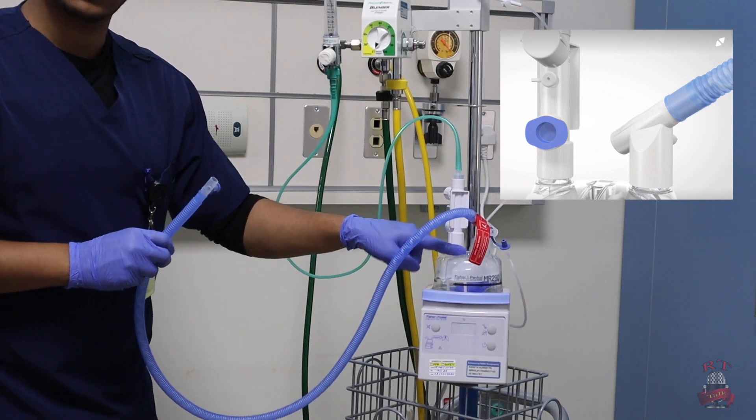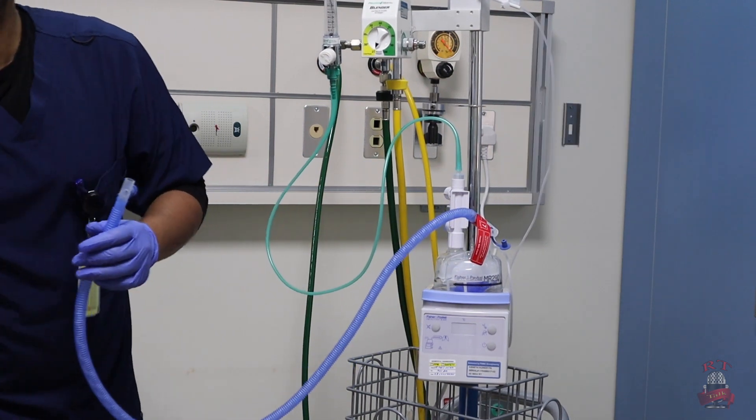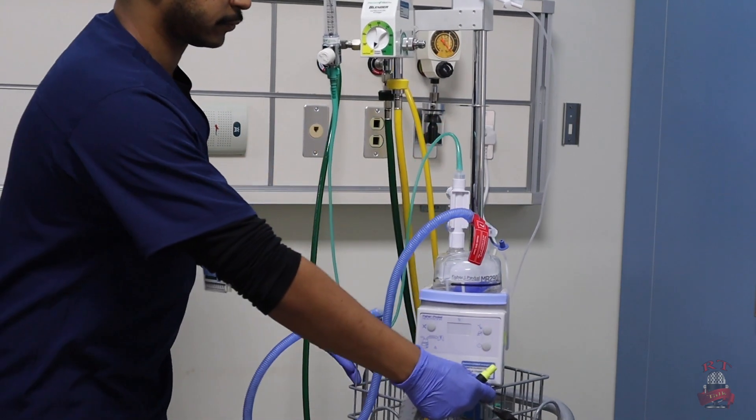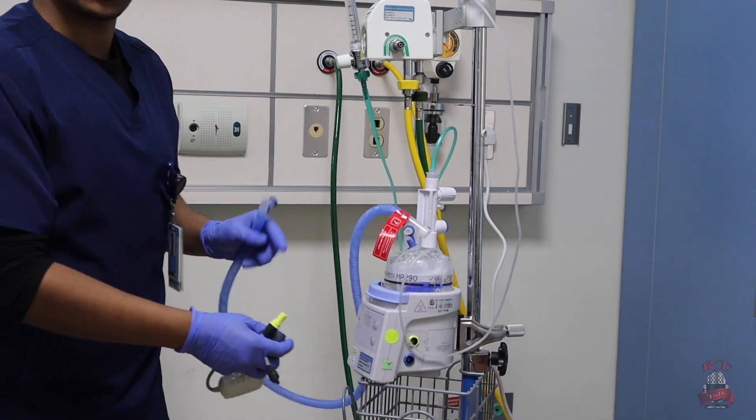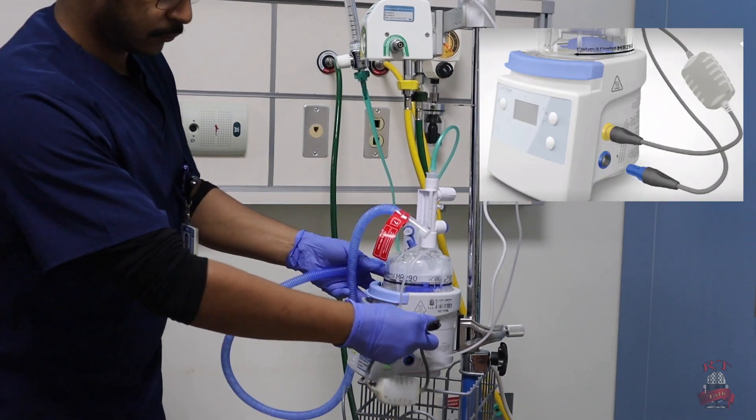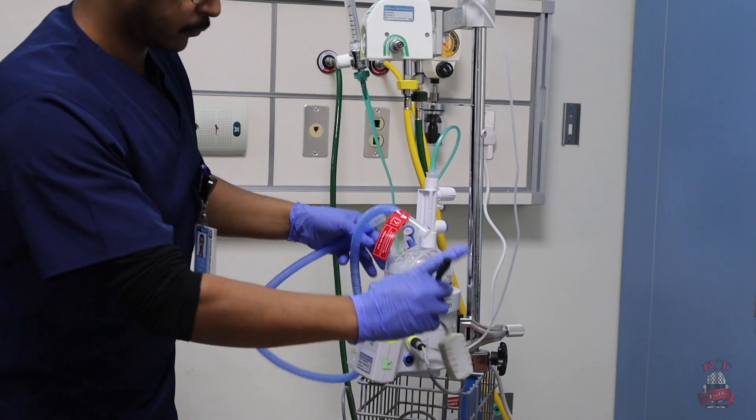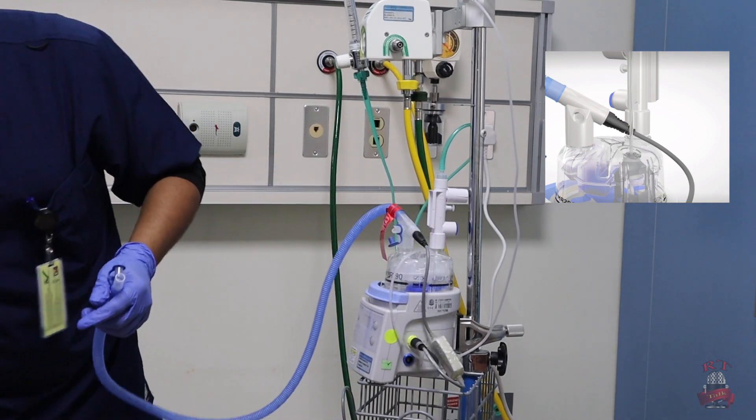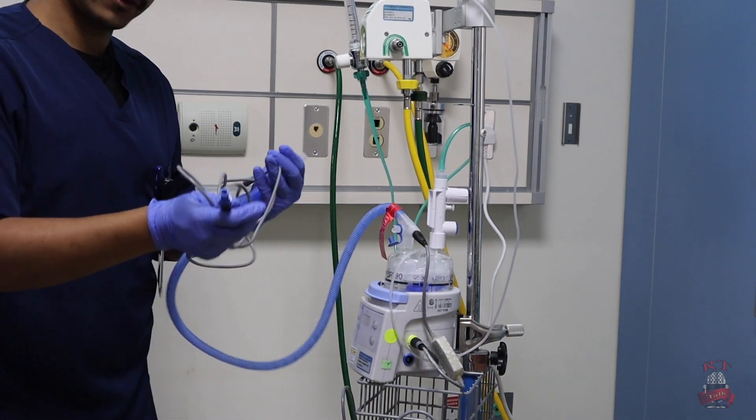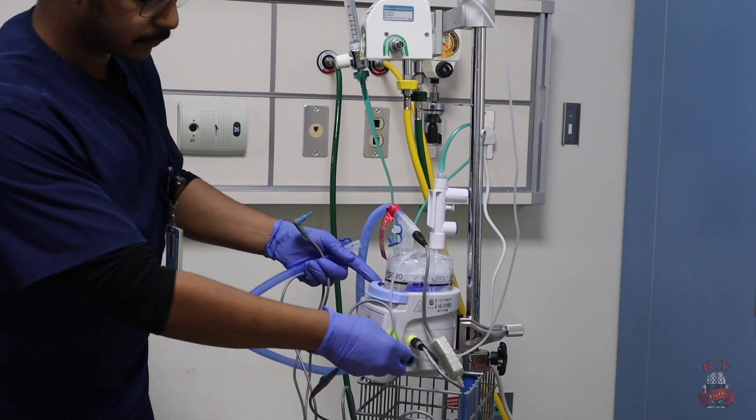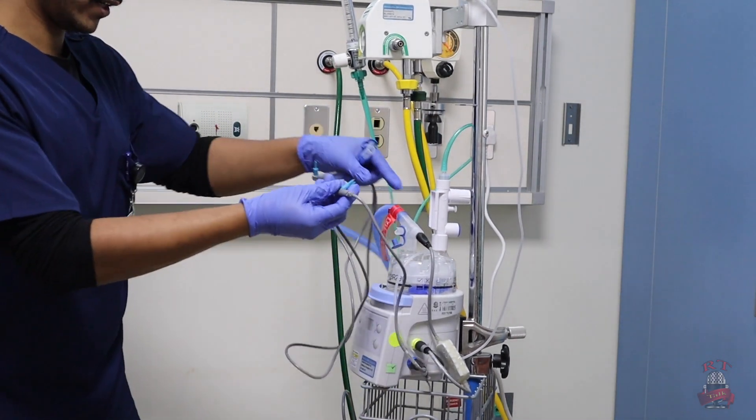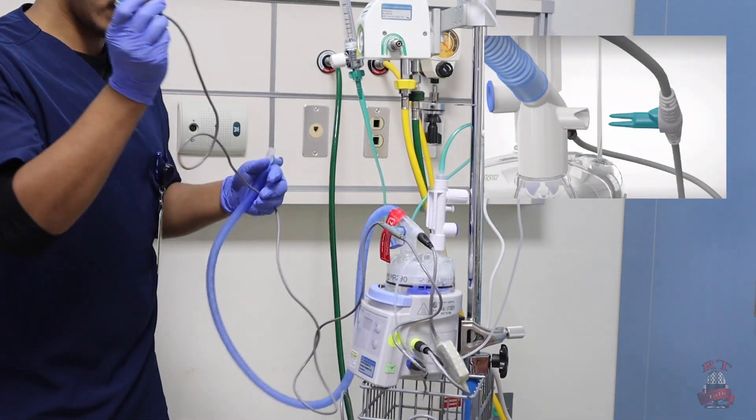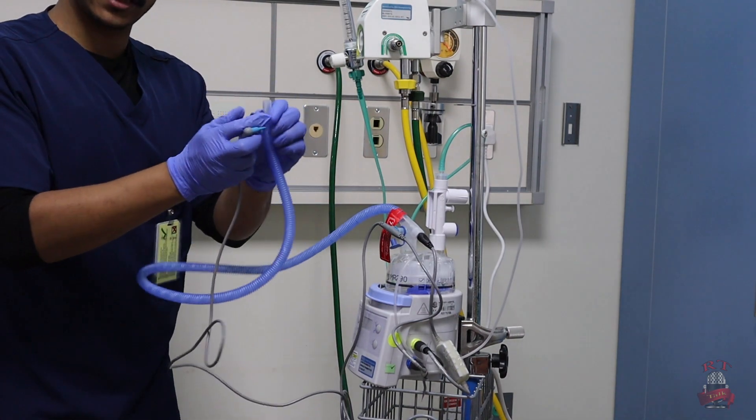Now we will connect our cables for our humidifier. We found the opening on the side of the humidifier and the end of the humidifier also. The other cable for the sensor. One in the beginning of the inspiratory limb, the other one in the end of the inspiratory limb.